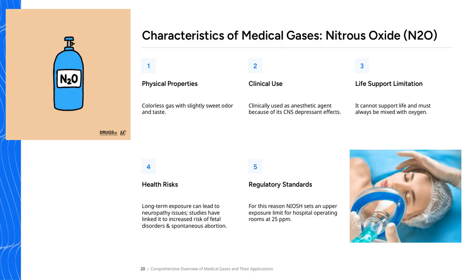Finally, on physical properties, nitrous oxide is a colorless gas, and it has a slightly sweet odor and taste, which is often noticeable when it's administered. Understanding these properties helps us handle it properly and recognize it in clinical settings.